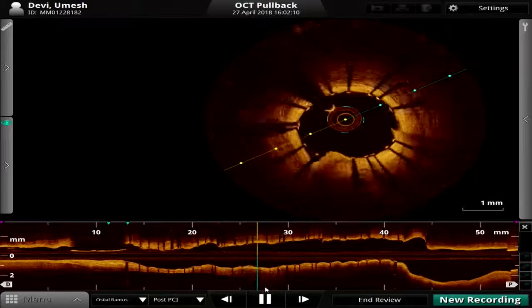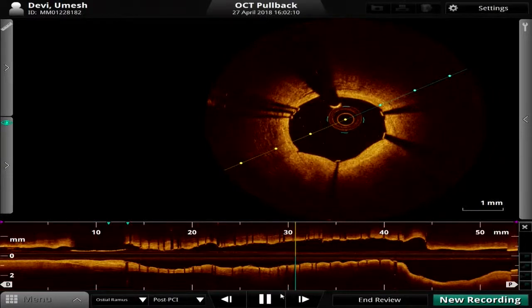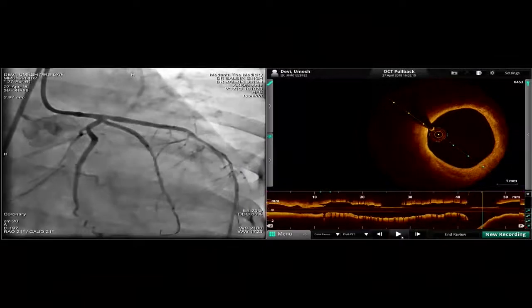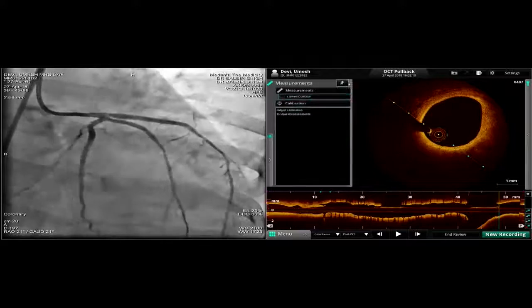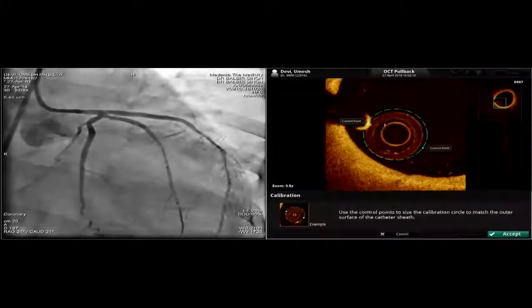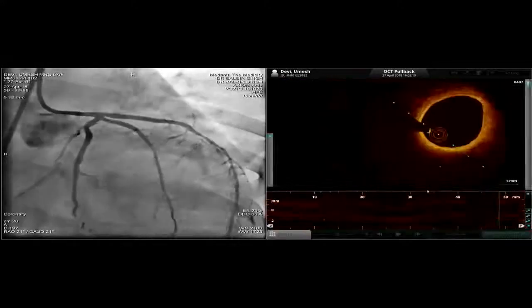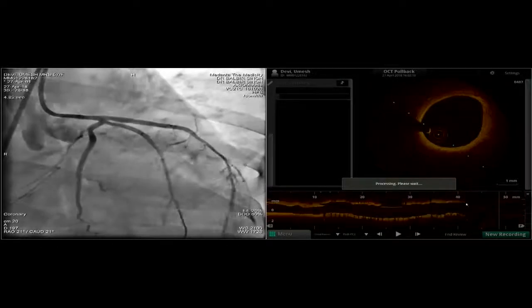2.25, 15 or 18. Look in the lineage. 16 then. See, the left main is fine. Yeah, the OCT of the left main is more than 10 actually. It looks much better in OCT than on the fluoroscopy with angio. So I'm taking another stent which is 2.25, 16, another Biomime, and you saw that the proximal part of the stent was very nicely covered at the circ.